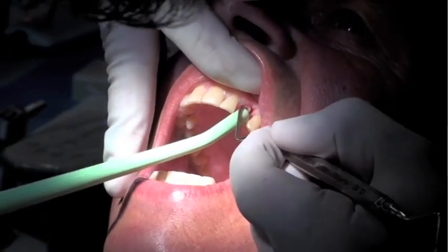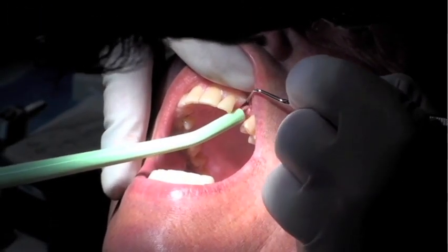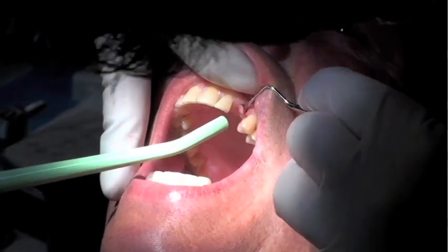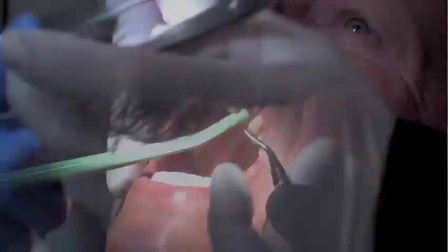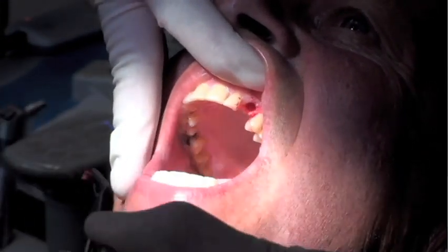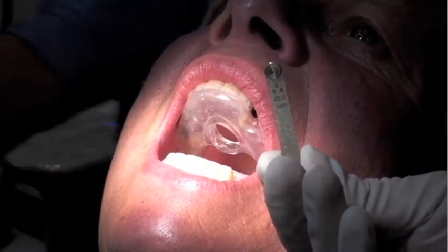Once the tissue punch is done, the guide is removed and the soft tissue plug is carefully removed. Salvin Dental has a curette that is sharp and can cut the base of the tissue plug for ease of removal. Rongeurs are used to remove that final tissue tag. The area is cleaned and we can commence with the osteotomies.